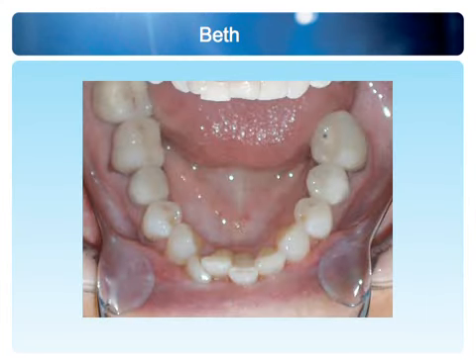The lower arch. We didn't even look at it yet, but now we can get a view of what's here. Oh, it's a pretty severe amount of crowding. It's the kind of picture we would look at and immediately say 3 incisor fit there. And there is nothing wrong with this statement, because if you look at these 6 teeth, certainly only 3 would fit. But we haven't given them their due diagnosis and treatment planning.